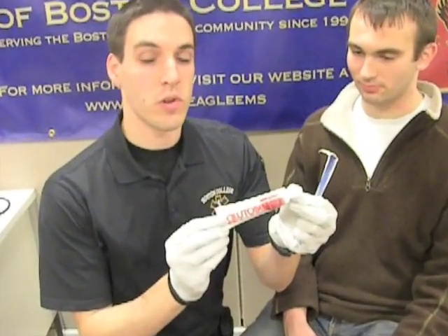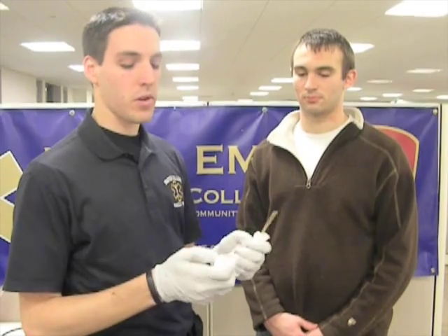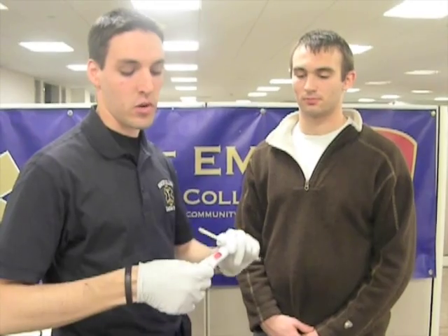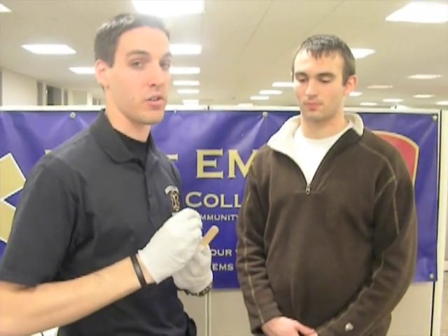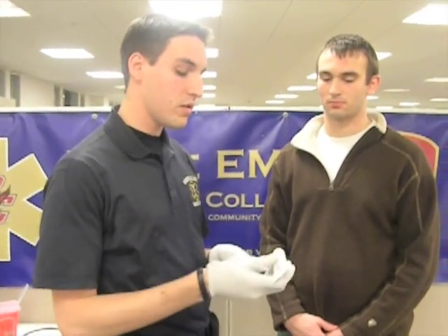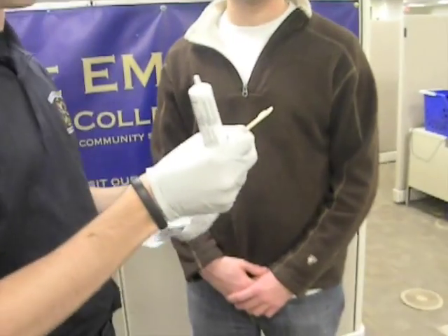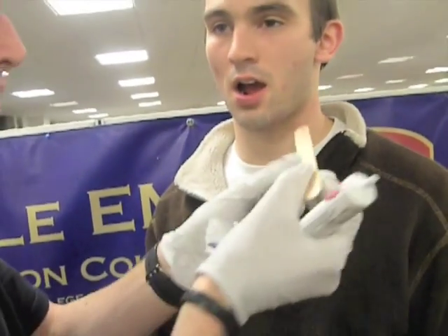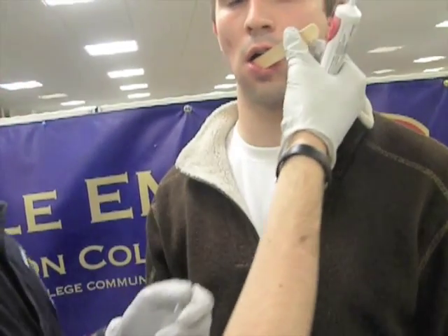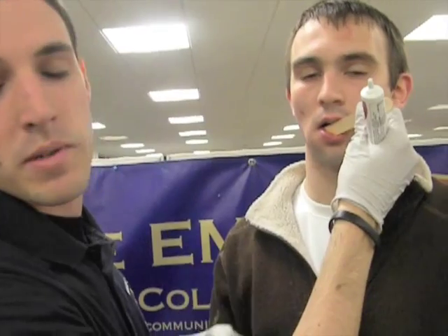This is your tube of oral glucose. One dose equals one tube. So let's say our blood glucose reading was down around 50 — we'd be giving Gus some glucose right now. We want to make sure that he's able to swallow and protect his airway, because otherwise we could cause the patient to aspirate on the glucose, and then we have a bigger problem. The procedure is to open up your tube, squeeze a little bit on the end of the stick, and then place it in between his teeth and his gums, and it'll absorb right into the mucous membranes there and be absorbed into the bloodstream.